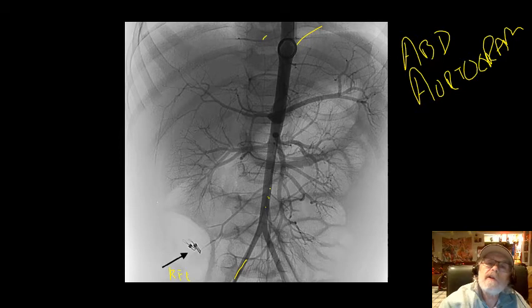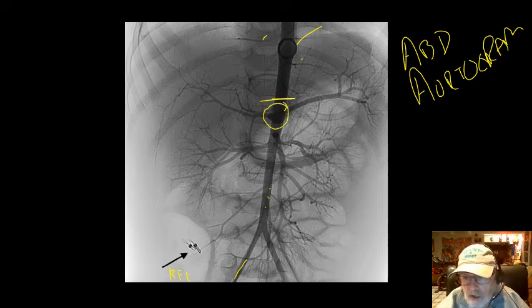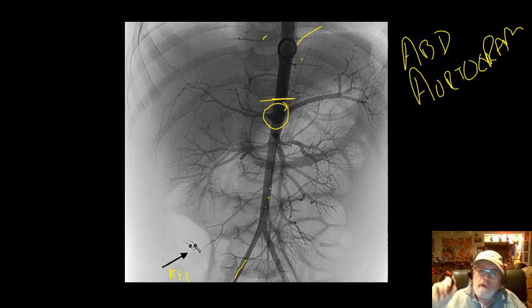You can see an intercostal artery here. What happens is now the diaphragm is going to sit somewhere in this area right here. This is that first big branch right there. And what happens is the aorta has a large branch that comes directly forward. This is just a matter of maybe an inch and a half below the diaphragm.